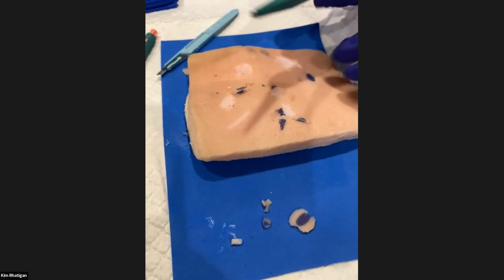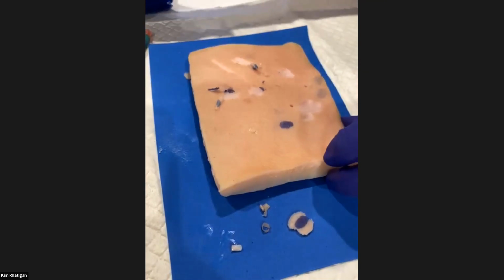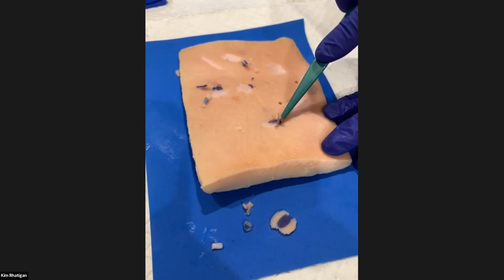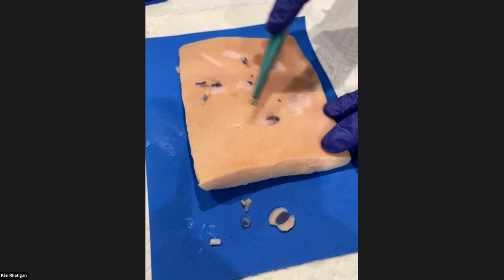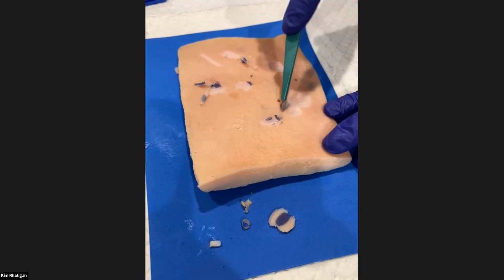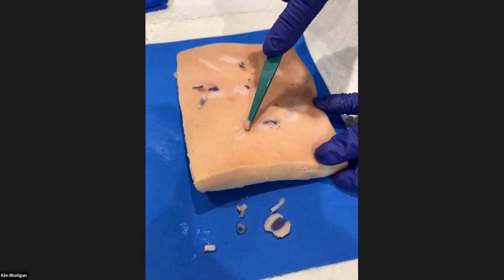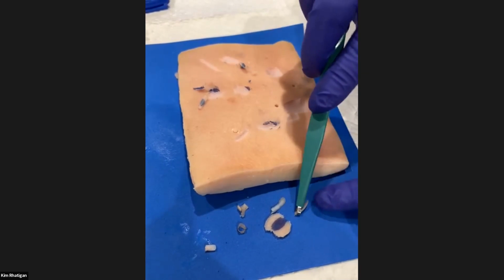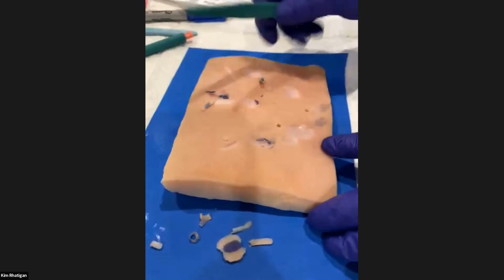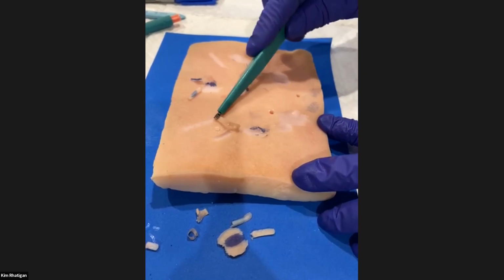I keep these in my doctor's bag along with several punches as well. Let me turn around like this. Put this sharp over here. You can also buy this pig skin at the supermarket. So if you really want to go crazy and practice during this time that we're home on Zoom, you can certainly get yourself more of this. It's called Fatback, and Boar's Head sells it, or Smithfield's, and people cook with it. They put it in different kinds of stews. So that is our final tool, the curette.